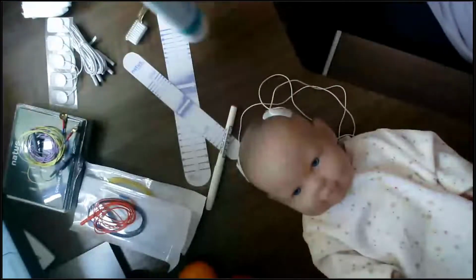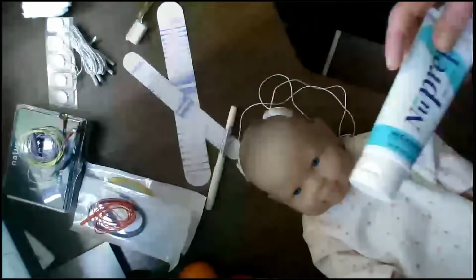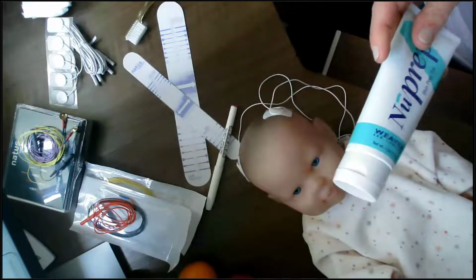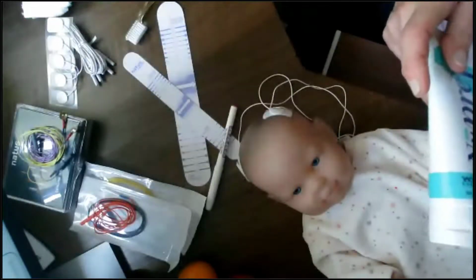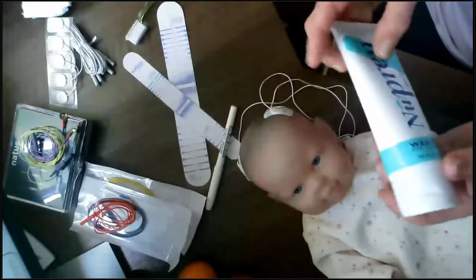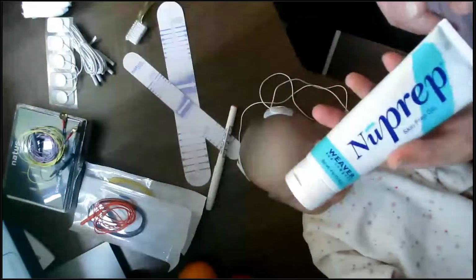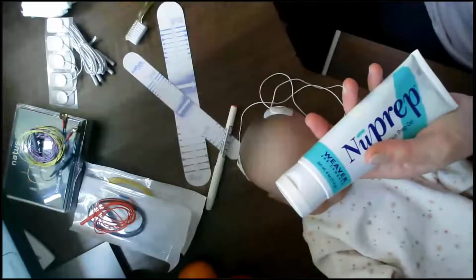Now, we talked about the skin preparation. Skin prep is very important. Skin prep is going to remove any dead skin off the baby's skin. So we use NuPrep. It's a really great skin cleansing agent.